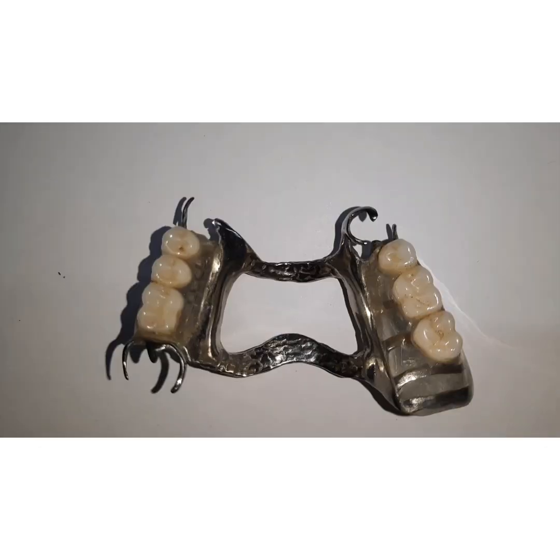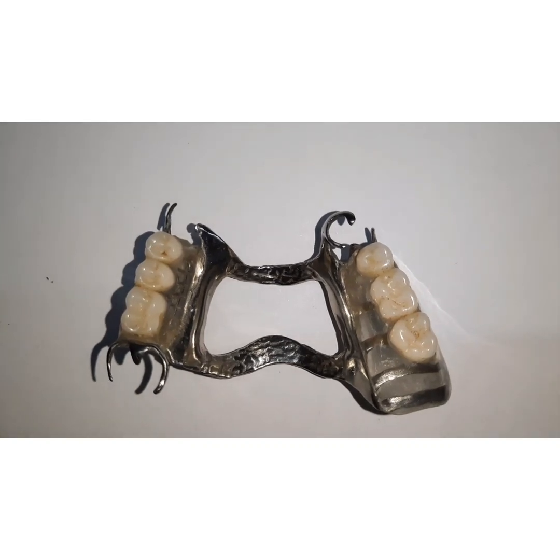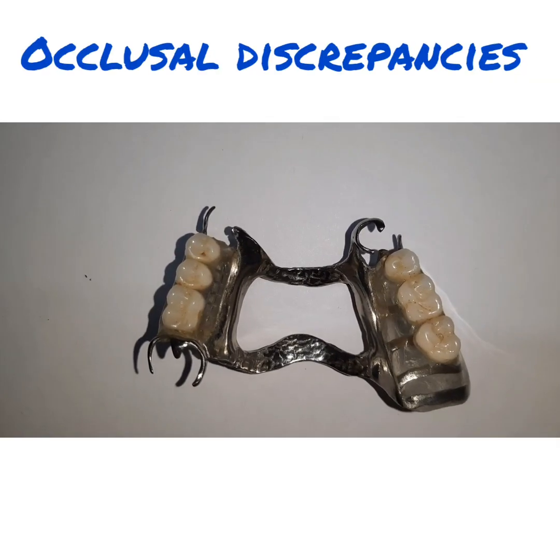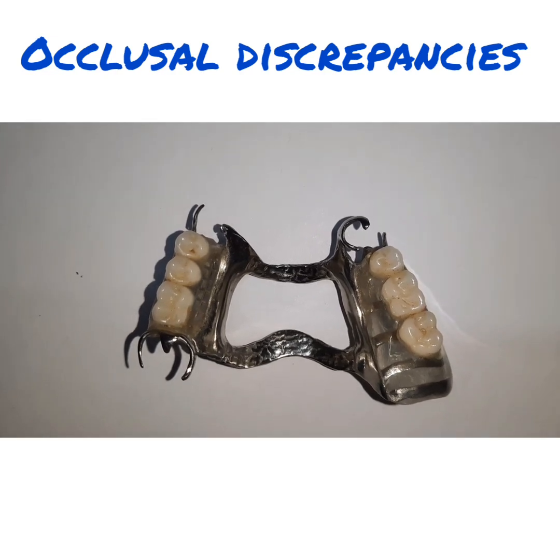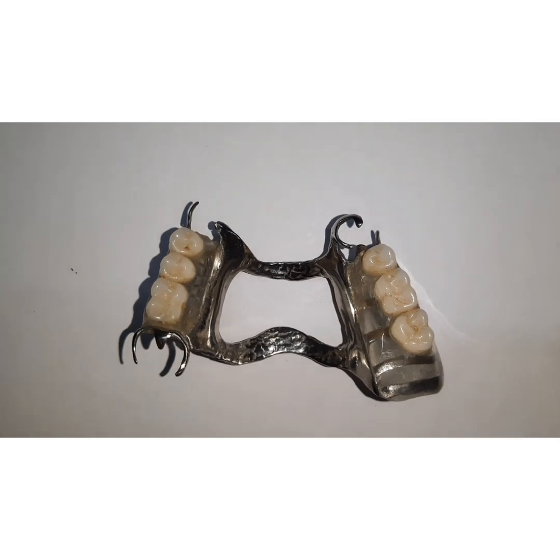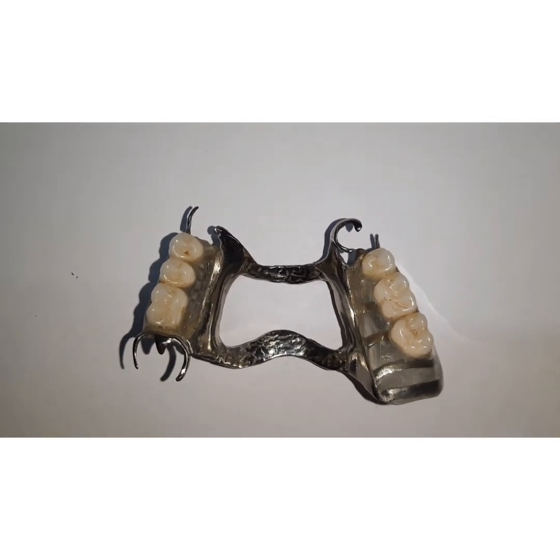of the prosthesis. Third troubleshooting can be because of the occlusal premature contact. Any premature contact is identified and reduced accordingly at that particular position, and then after reducing it is polished.